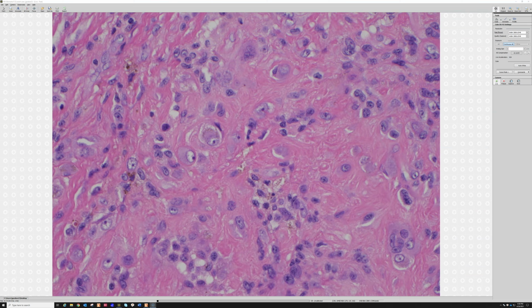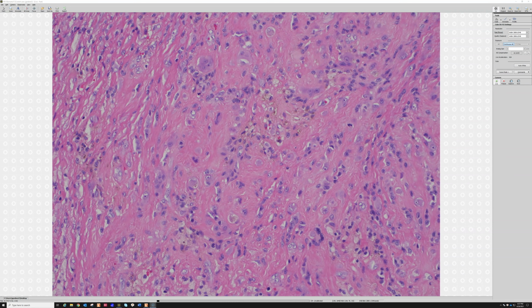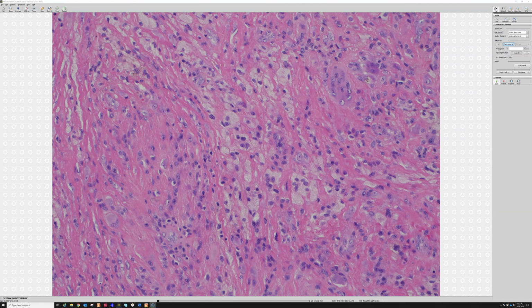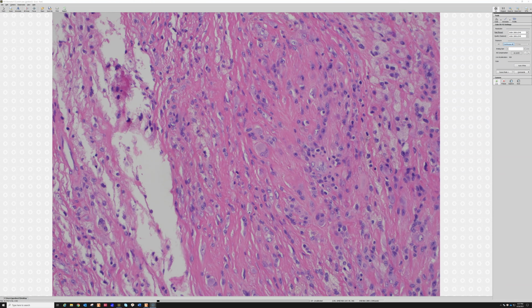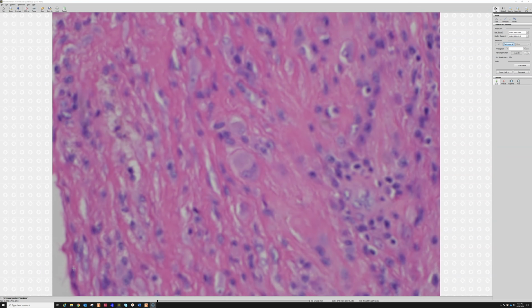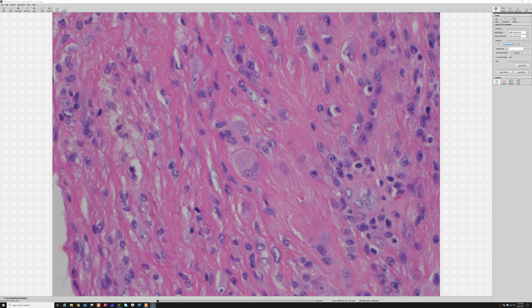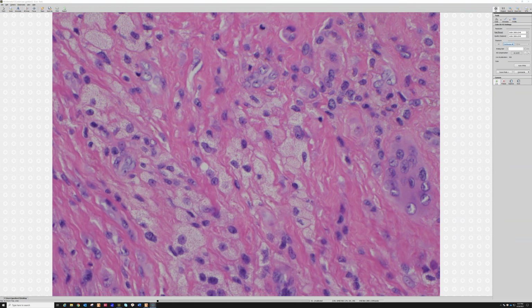Sometimes they're binucleated, and when they have that ring of hemosiderin, I like to say they have a halo, like an angel, like a halo of hemosiderin. But I believe that some others have called them ladybird cells, which is the British word for ladybug, I believe. If you haven't seen one of those, you can go Google it. I guess that's kind of like a ladybird cell. It looks like a little ladybug because it's got those two little round fake eyes on top. Okay. And then the foamy histiocytes I find quite helpful.